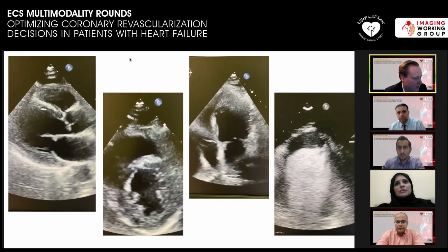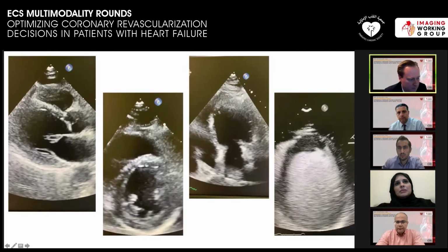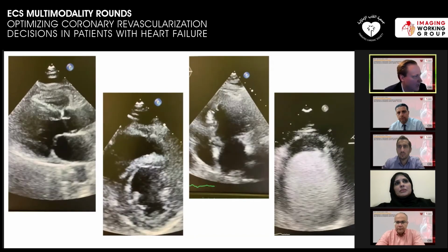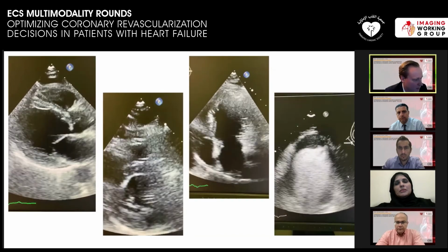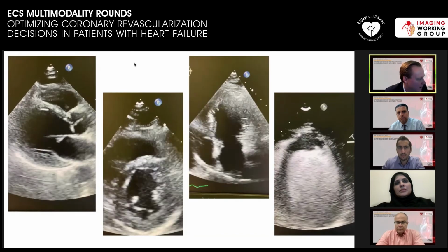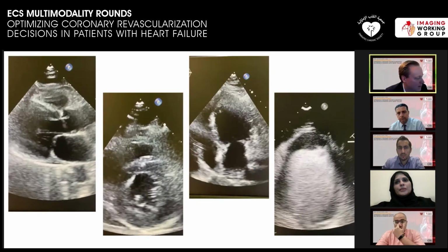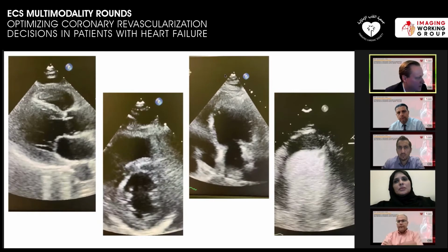And in terms of the echocardiogram, something worth emphasizing is that we really use viability testing when the wall thickness on the echo is thinned out and akinetic, right? Here there's a thrombus, and there may be some thinned out akinesis involving the apex, but I would argue that a lot of the LAD distribution, that anterior septum, is normal wall thickness and contracting, and hence viable.